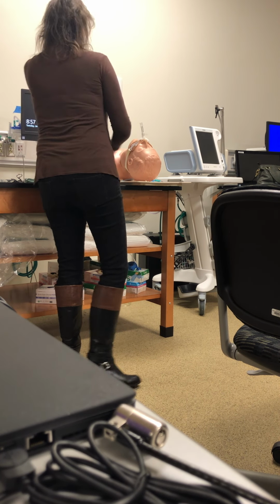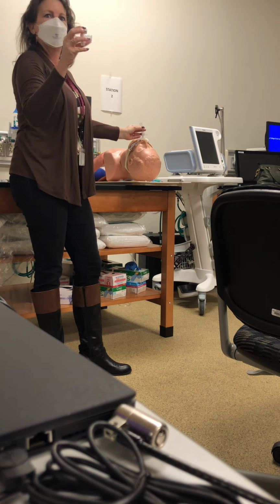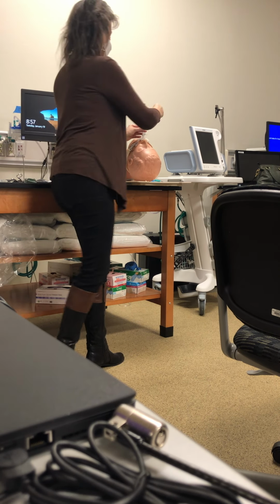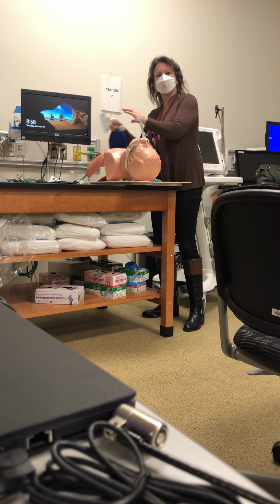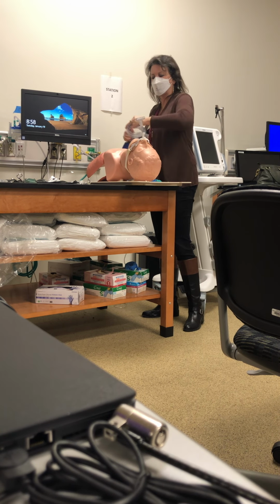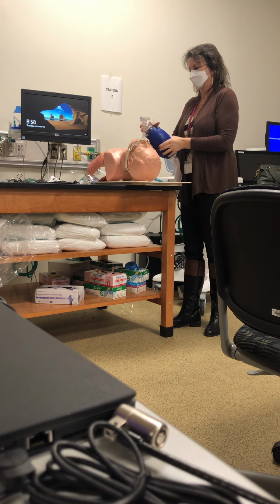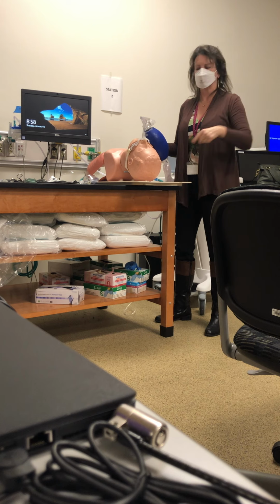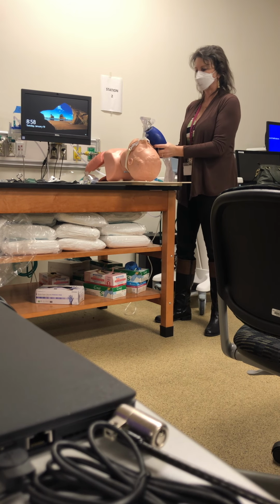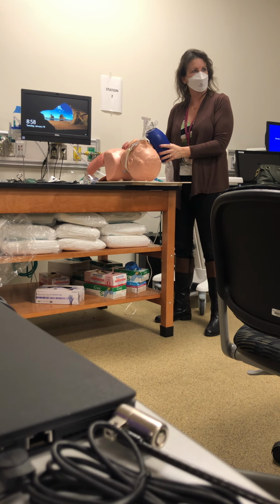Once you have done that, we're going to place the CO2 detector on, just like this. And I'm going to give a breath. So it's purple and then it goes to yellow once it measures CO2. I don't have any CO2, but once it's open to air, it's just going to turn yellow. So I give a breath and I have a positive color change because it turned from purple to yellow. So that means it's in the trachea, okay?